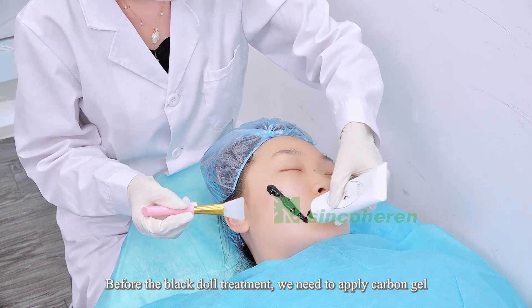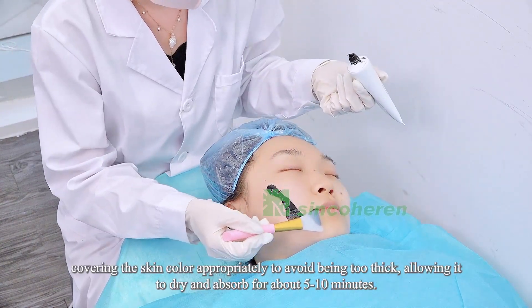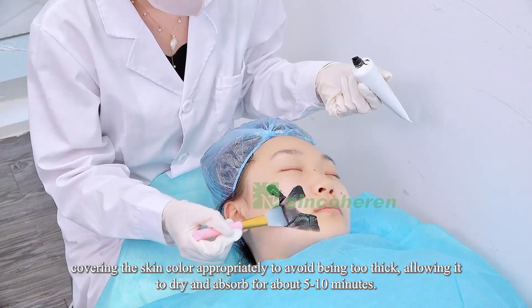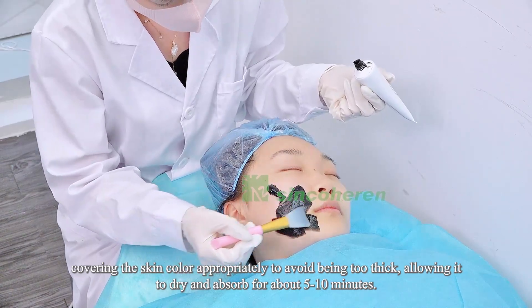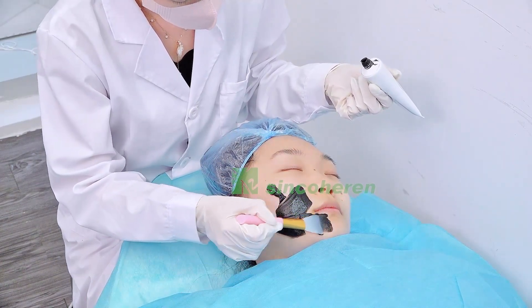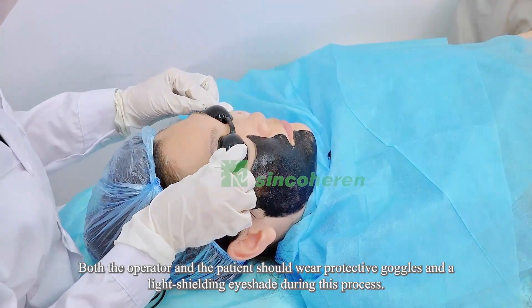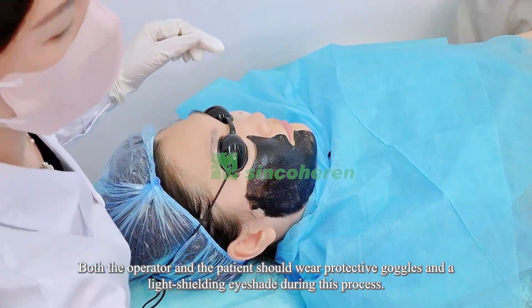Now we will present the carbon peeling treatment. Before the black doll treatment, we need to apply carbon gel covering the skin appropriately — not too thick — allowing it to dry and absorb for about 5 to 10 minutes.